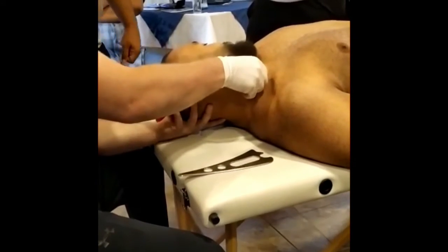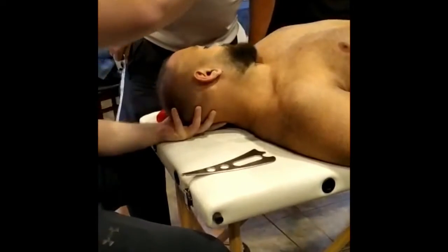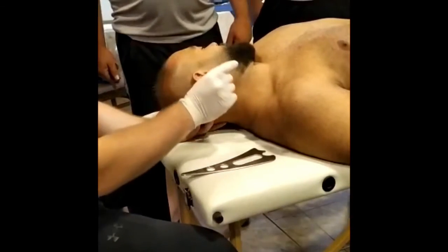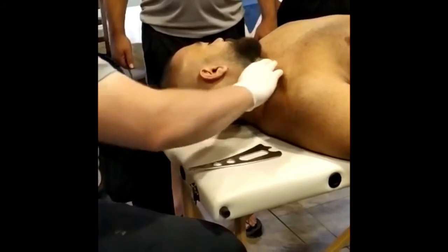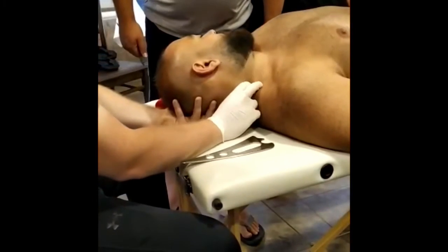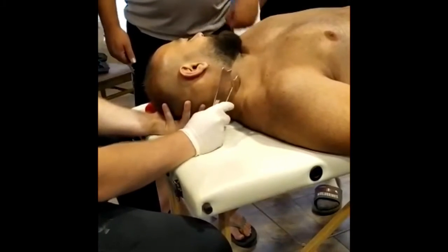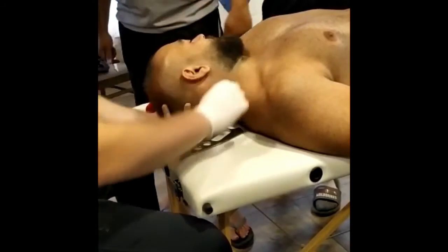I don't want anybody to go anterior to the scalene, like we talked about with the belly of the soleus. There are a lot of structures through here. I'm more comfortable with everybody using their hands. So anything between the trap, SCM, and through here, you can use that number three coming through this way. If you're going to go through the longus colli and stuff like that, use your fingers.